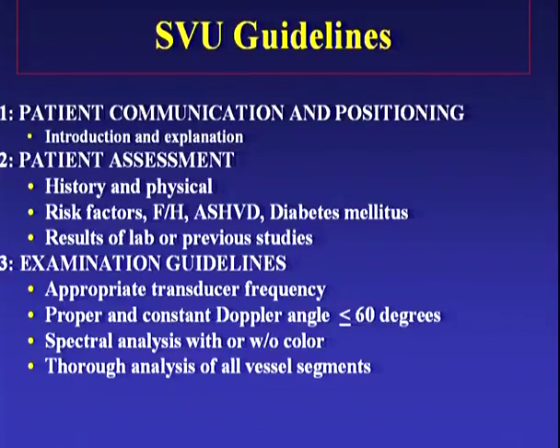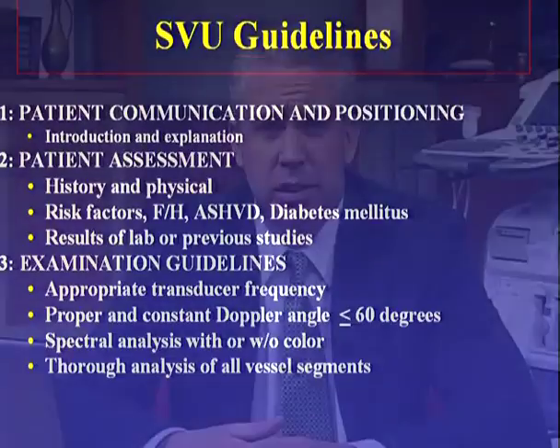In the examination guidelines portion, you want to make sure you're using the appropriate transducer frequency. Sometimes the patient will have a large edematous upper extremity for various reasons, and you may have to drop frequencies. Typically, the upper extremity will be a fairly thin extremity compared to the leg, and you can use higher frequencies, but sometimes to get into the subclavian or the innominate portion of this examination, you may need to turn to a curved linear transducer.